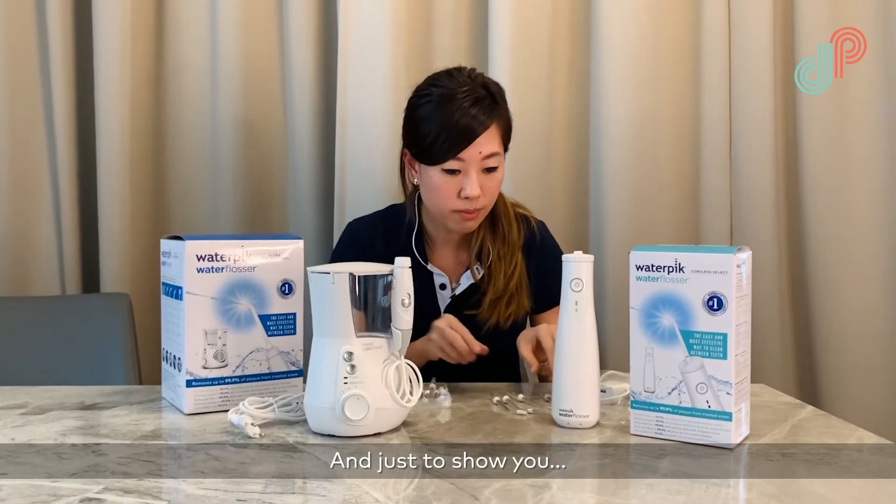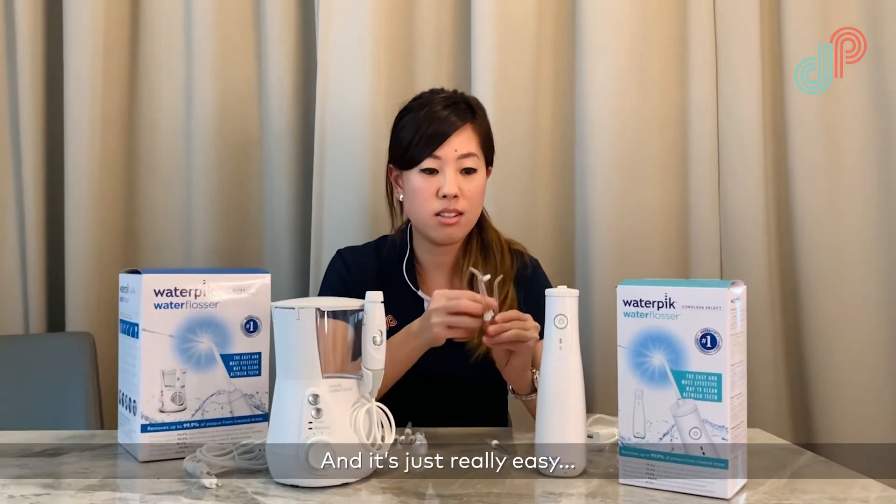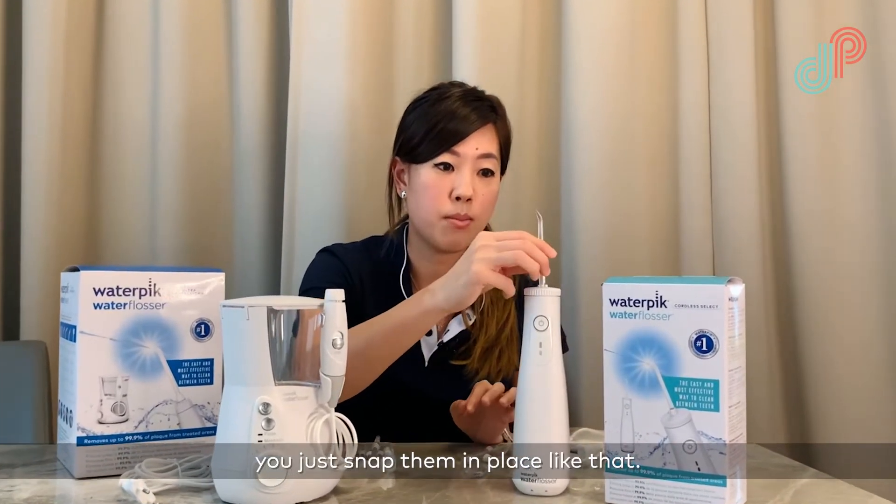This cordless version comes with four different tips, and it's really easy — you just snap them in place like that.